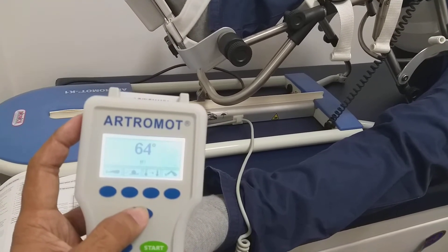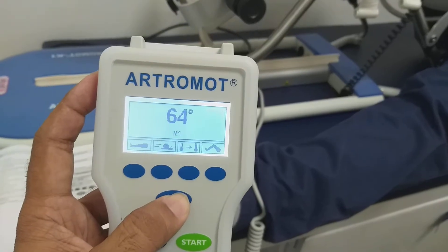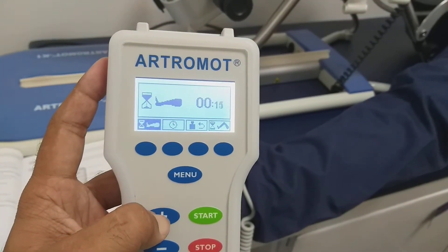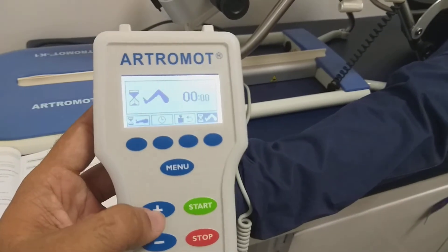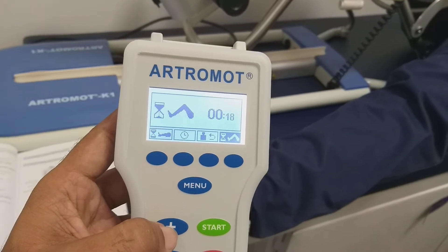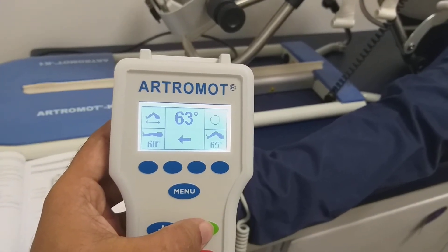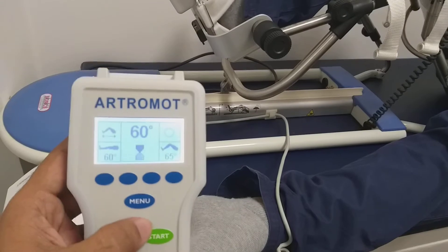If you want to change the flexion pause and extension pause, you can select M2. Then here you can see the extension pause — you can set the pause in seconds. The flexion pause can also be set in seconds, up to 59 seconds. So now I start again, with the angle set between 0 to 65 and pause time added in between.